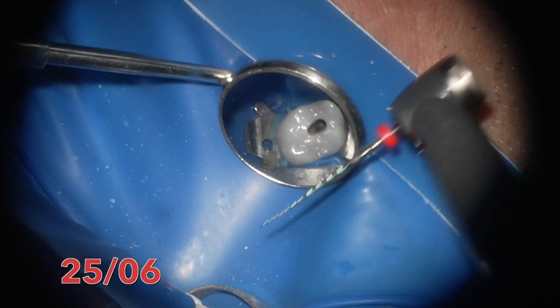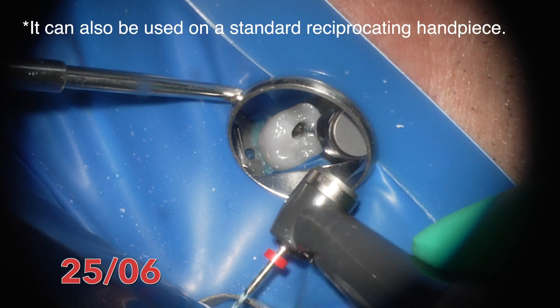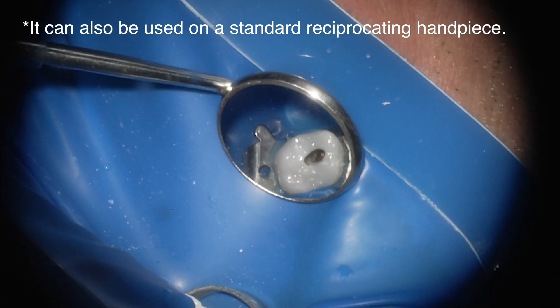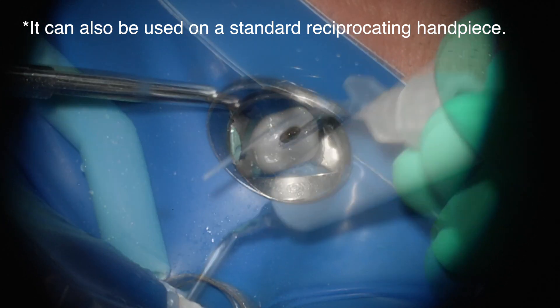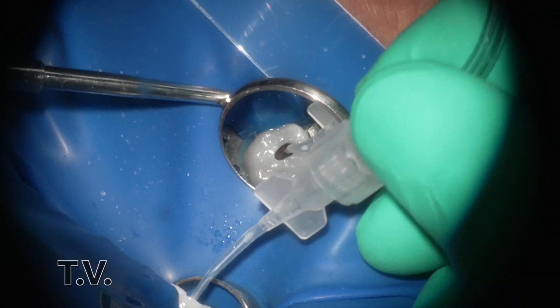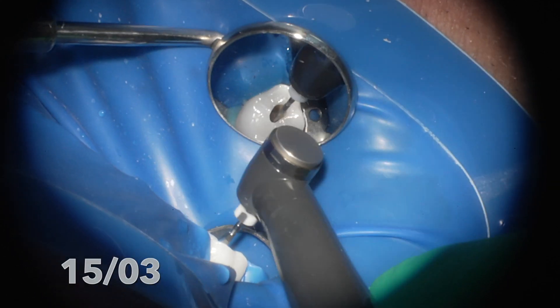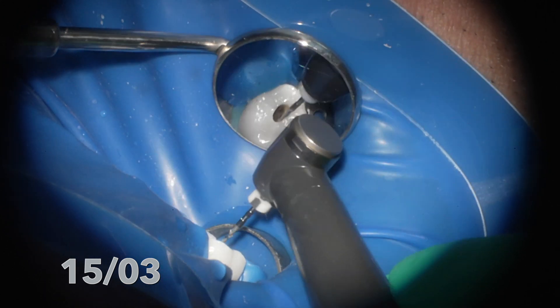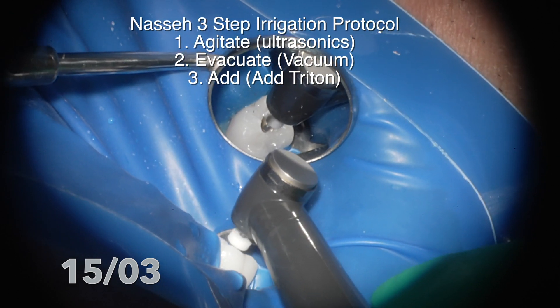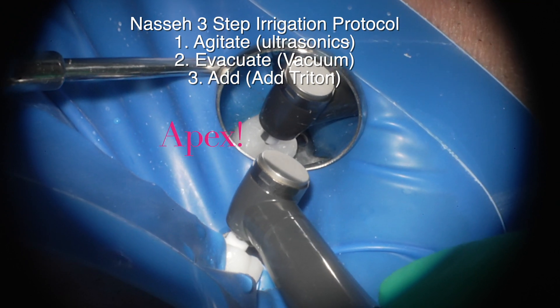I'm using it on my EndoSync Plus with 0.2 newton centimeters of torque on the OTR setting, so it gets into the reciprocation motion right away as soon as it engages the dentin. You can at times push the OTR setting up to 0.6 to get even more action. My full irrigation protocol: after cutting I do ultrasonics, then remove the solution with vacuum, then add Triton.